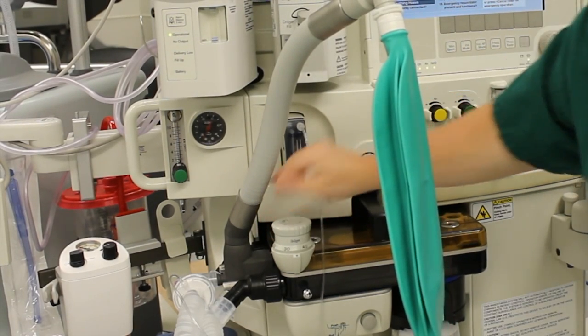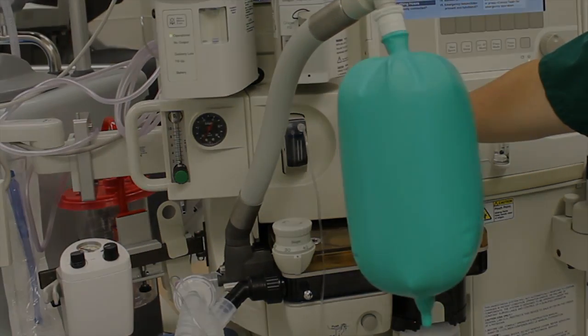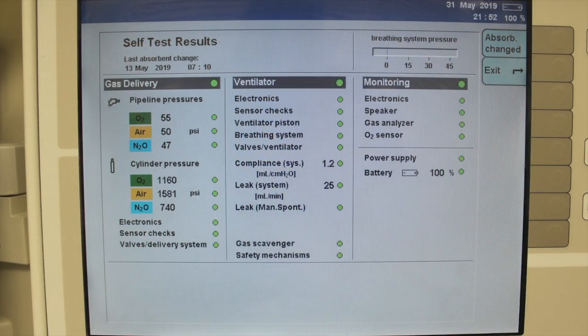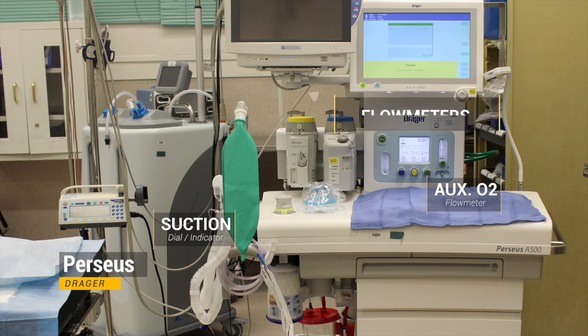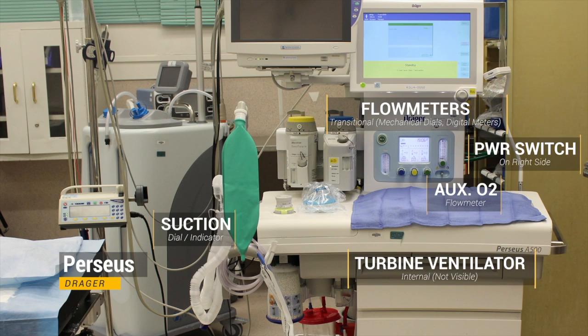In addition, pressure-controlled ventilation, PCV, has several advantages over volume-controlled ventilation, VCV, such as the resulting rectangular pressure waveform that provides maximal inspiratory pressure throughout the inspiratory time, facilitating lung recruitment. Compared with volume-controlled ventilation with the rectangular flow waveform, pressure-controlled ventilation and volume-controlled ventilation with a decelerating flow waveform provided better oxygenation at lower peak inspiratory pressures and higher mean airway pressures.